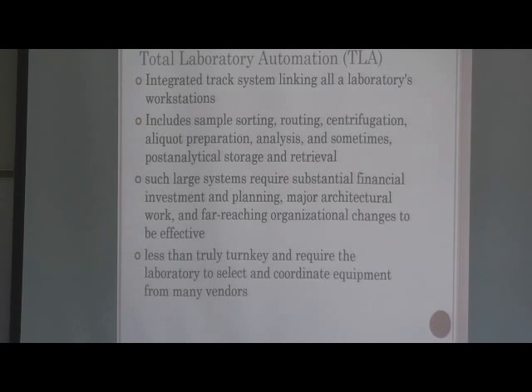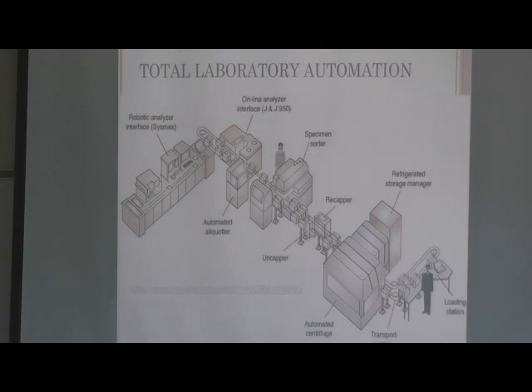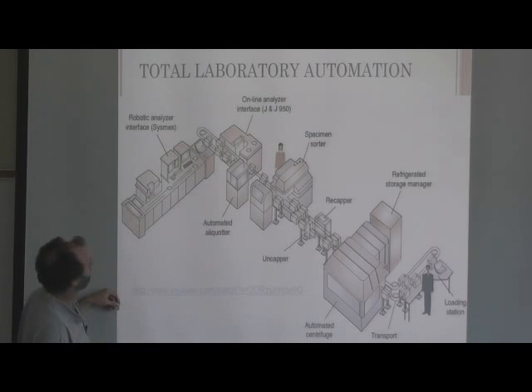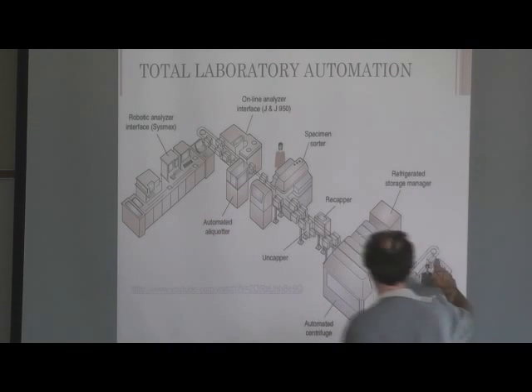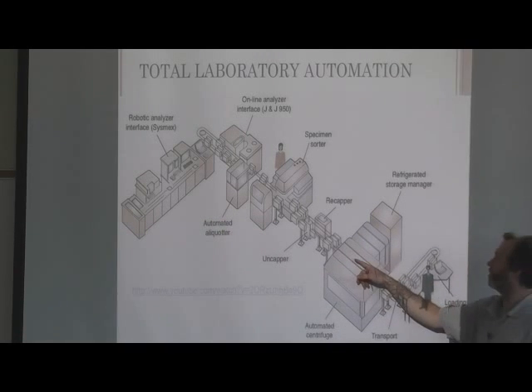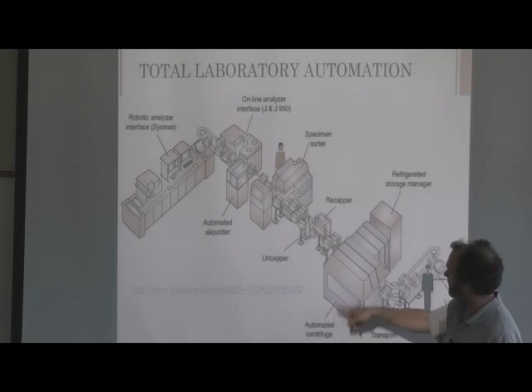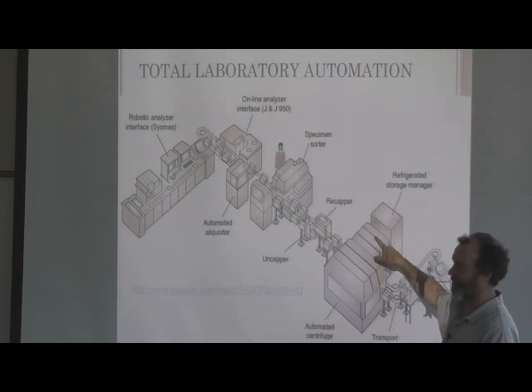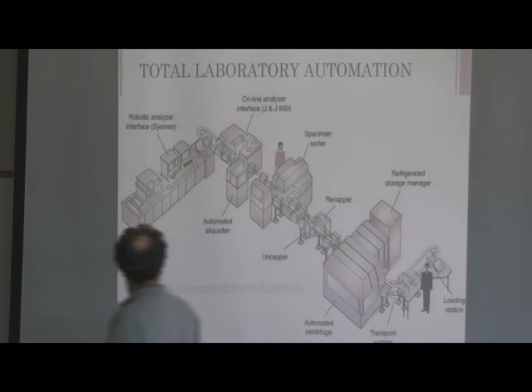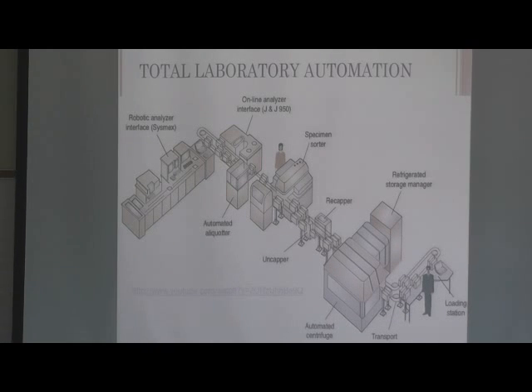So they look kind of like this. You've got the robotic analyzer interface. This is the loading station that goes in here. The samples will go to this automated centrifuge, through all the testing equipment, and then back to be stored in a refrigerator.